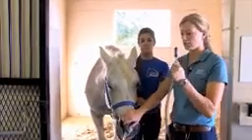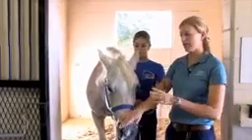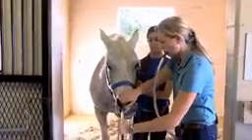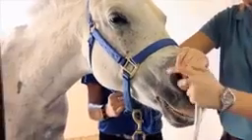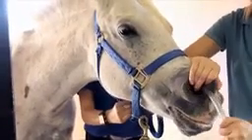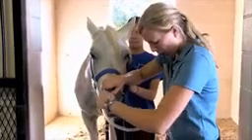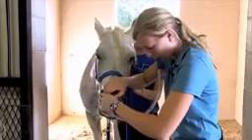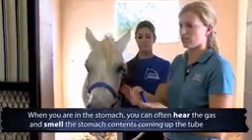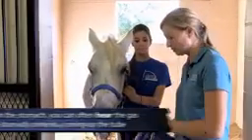So what I do now is I usually just hold the tube in my mouth, and I'll just blow on the tube as I pass it down just to kind of help open up the esophagus and then get in. You can tell when you're into the stomach. And now I'm in the stomach, and in this case you can hear the gas, and you can smell that it definitely smells like stomach contents in her stomach there.